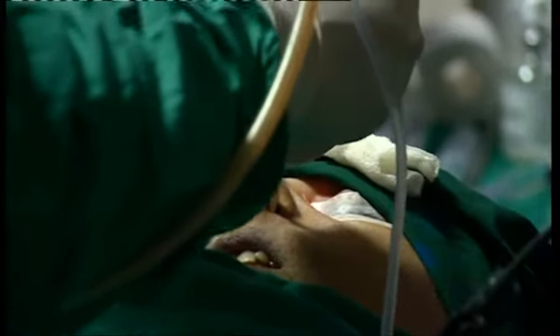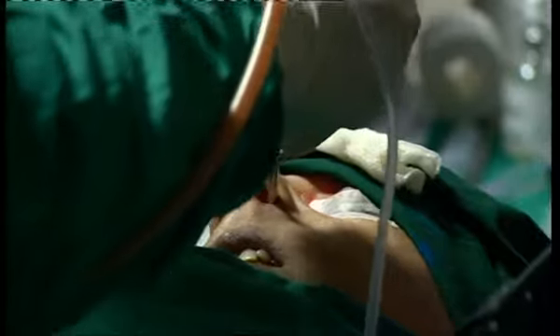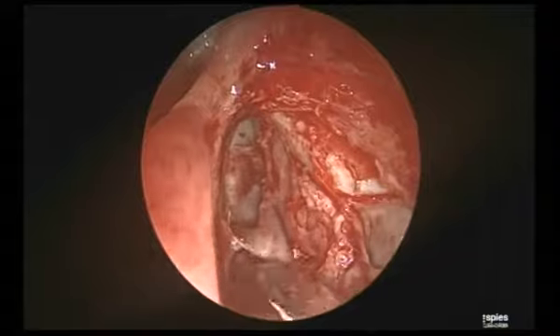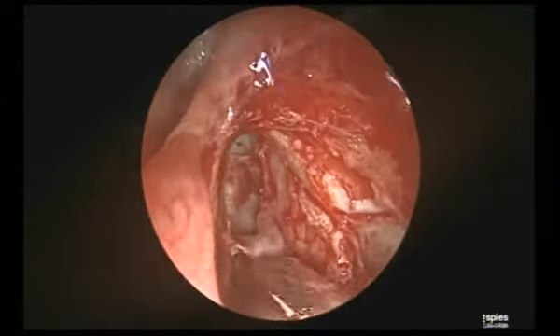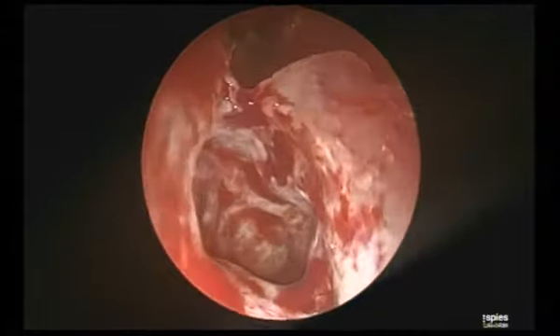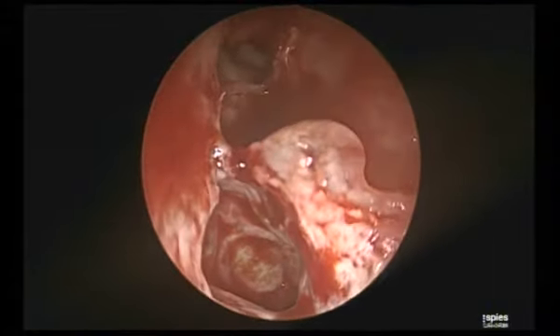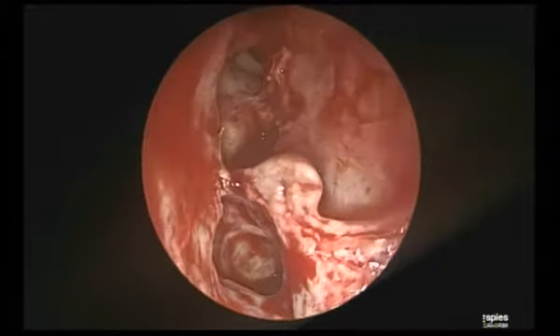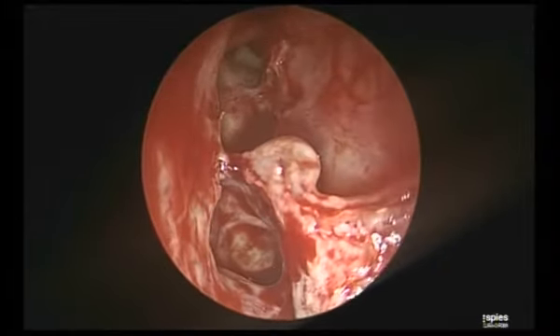See now, if I remove this anterior part of the bulla, you have to just show the stability. Okay, see now, what I'm trying to show is where the bulla goes up to the skull base. Can you see this? The upper part of the bulla going to the skull base, anterior to this artery. It should be very, very clear with no confusion. The bulla goes up to the skull base, just anterior to the artery.